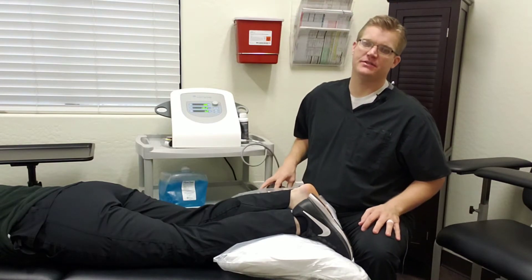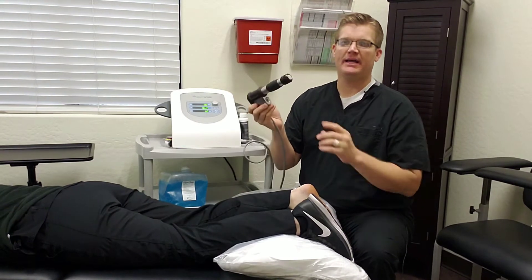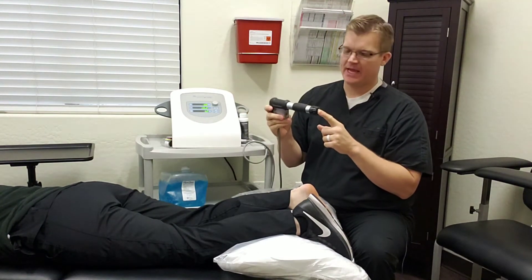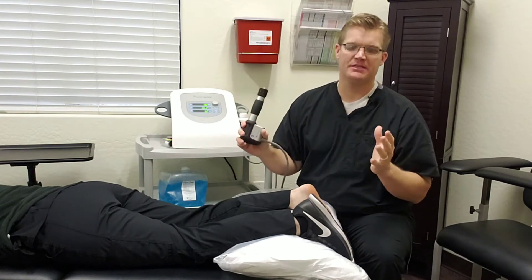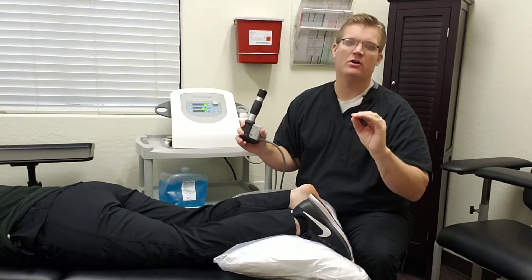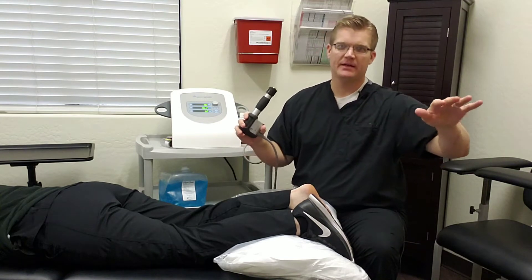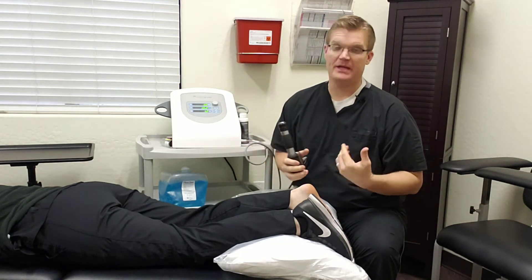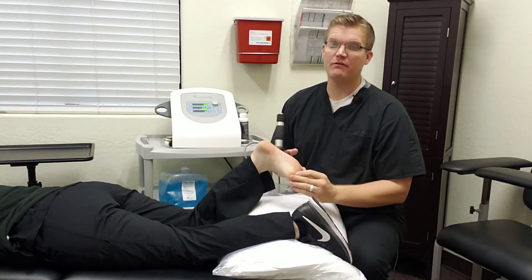This is kind of what the device looks like — it combines ultrasound and a radial pressure wave. The most basic explanation would be: if you've ever thrown a large rock into calm water in a lake and seen the ripple effect, imagine that pressure wave being applied to scar tissue.